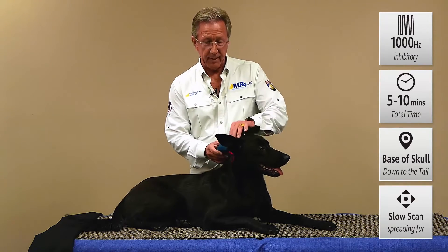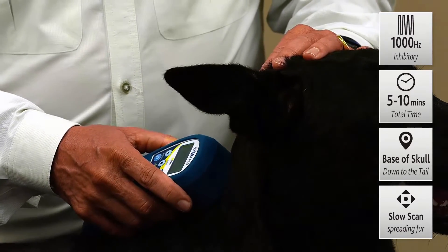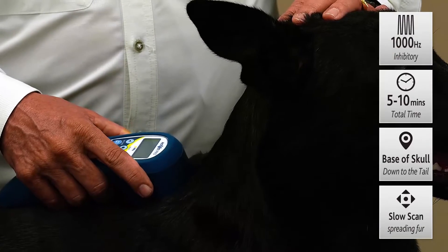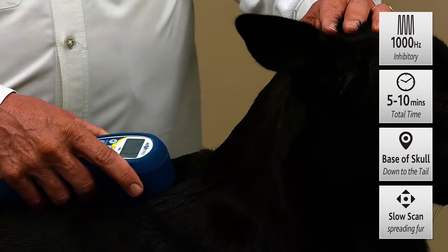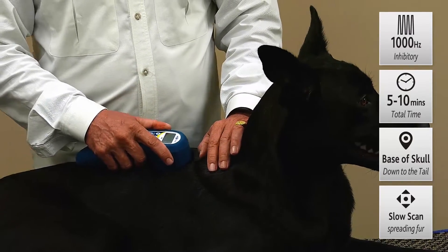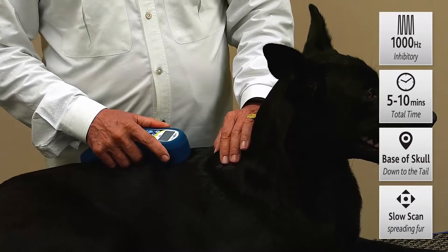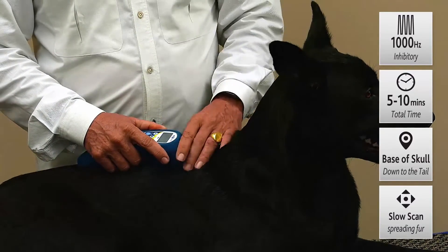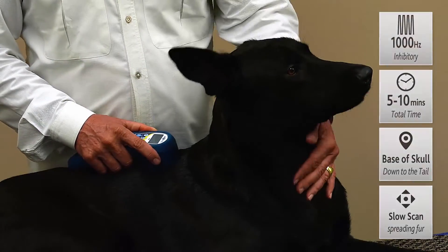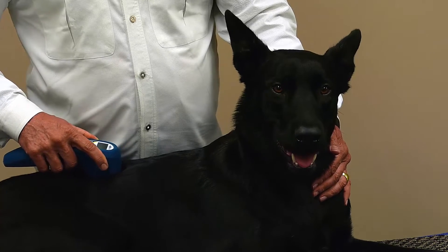We'll start up here at the base of the skull and slowly work at about a centimeter per second right down the spine in a nice slow loop, just letting that energy soak in. For those of you that have used a class 4 in the past, it's a bit of an unlearning process because you don't have to be moving it around to avoid thermal overload. There's no overheating possible with our lasers because the super pulsing means pulse durations in nanoseconds — billionths of seconds — no worries about heat buildup because there is none.